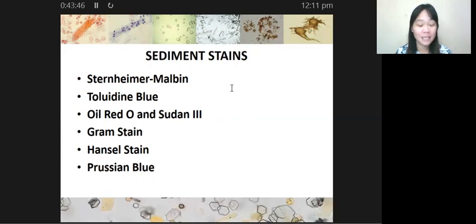In one reference, ang nakalagay dyan sa module nyo ay 1,800. But in Strasinger, ang nakalagay po ay 2 million. So, I want us to follow 2 million. Okay, so greater than 2 million, so we have renal disease. So kung WBCs and epithelial cells greater than 2 million, renal disease. And then lastly, we have your hyaline casts. If they are present greater than 5,000, again, it indicates renal disease. Okay, so yan, in-explain ko lang po.